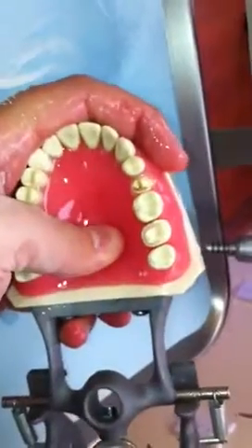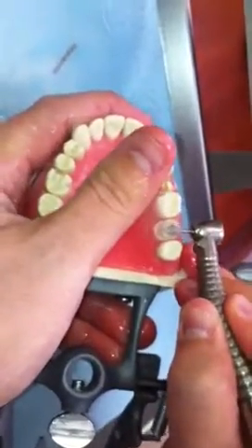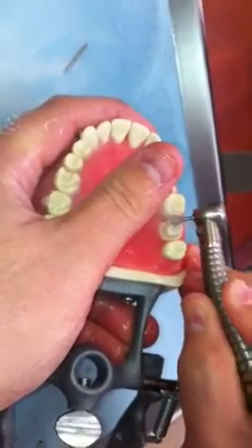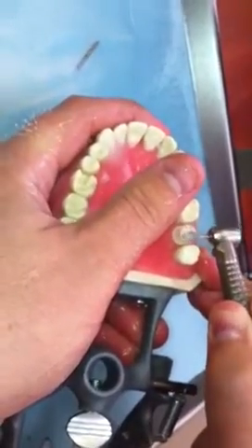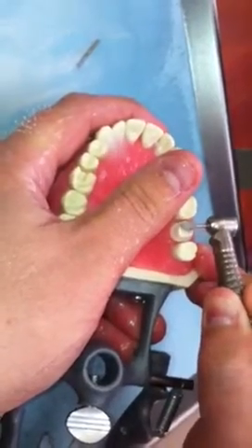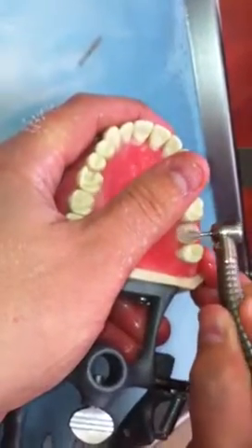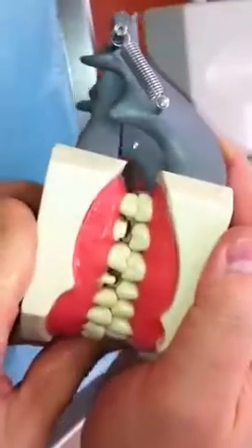It looks a little ugly there, but want to fix that? Pretty, huh? We're working on our prep here. Functional bevel — on steroids. It's always recommended to cut the occlusal and remove the filling. And that's our 2mm occlusal clearance.